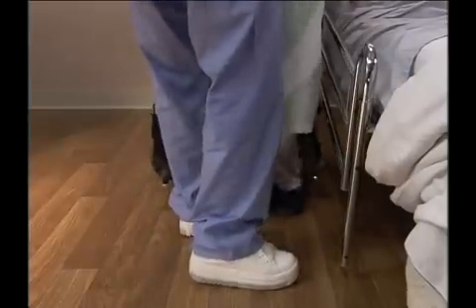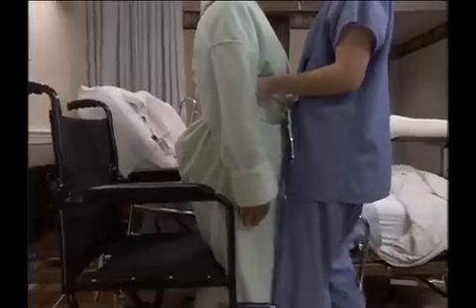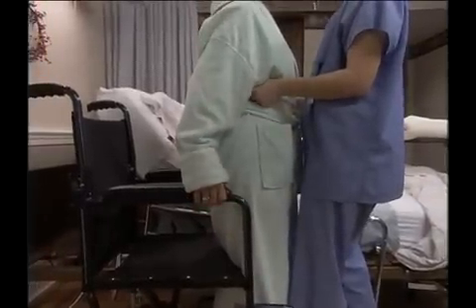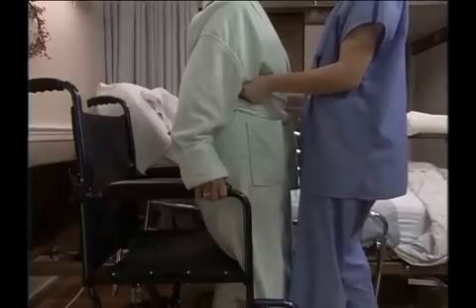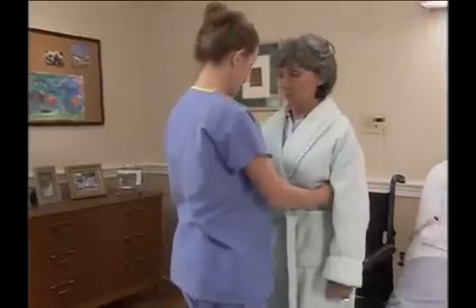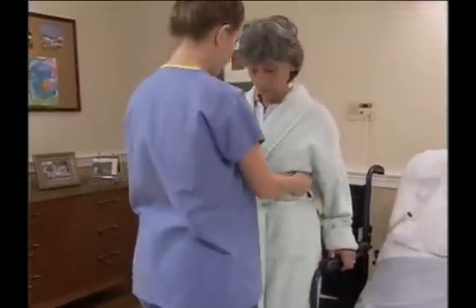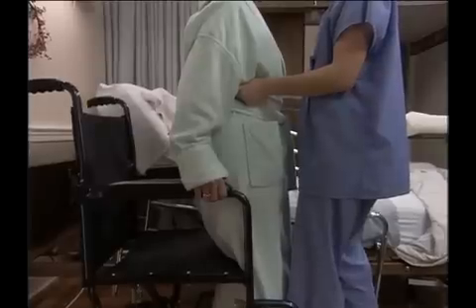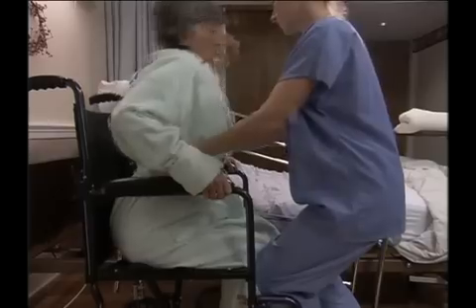Help the person to turn by pivoting on the stronger leg toward the chair. This will allow the person to grasp the far arm of the wheelchair. Make sure the backs of the person's legs touch the edge of the chair. Continue to assist the person with turning until she is able to grasp the other armrest. Then, gently lower the person into the wheelchair by bending your hips and knees.